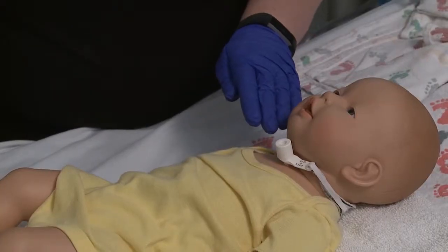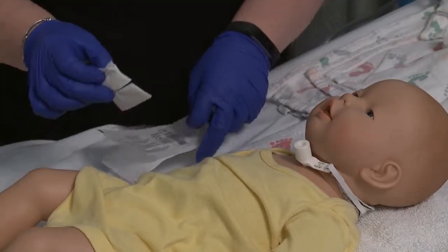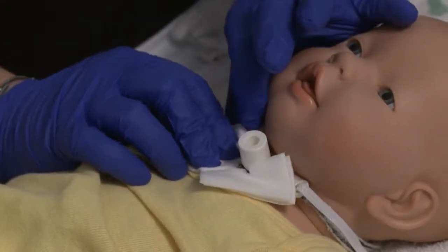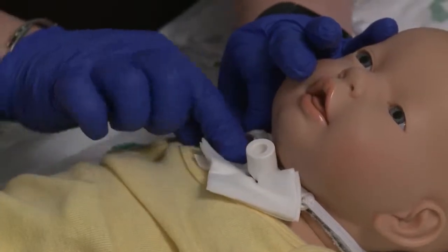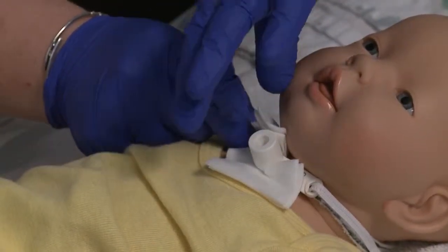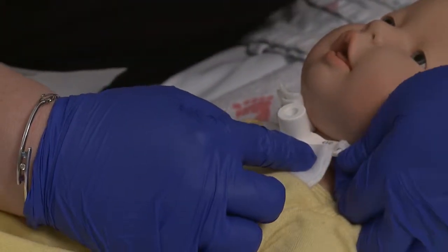After cleaning the tracheostomy site, you would put a new drain sponge on. This is nice and clean and sterile. You have to tuck this up underneath the trach, always maintaining your trach secure and stable. This just tucks up underneath and you pull this up — this may take some time. One side and then you would do the other the same way.